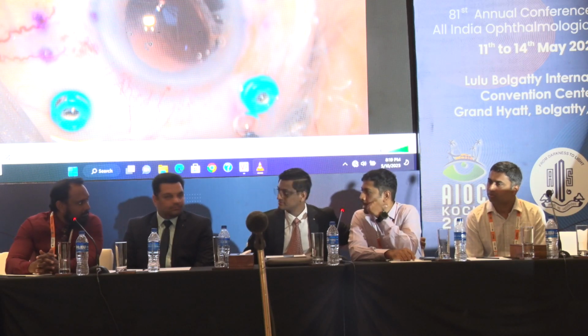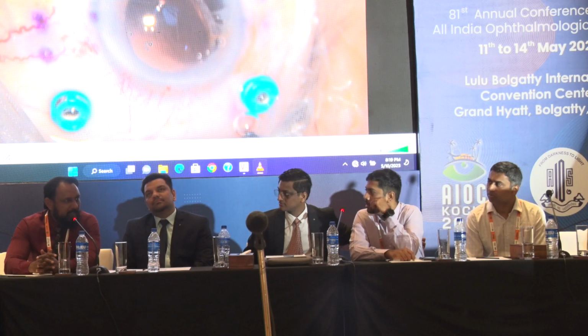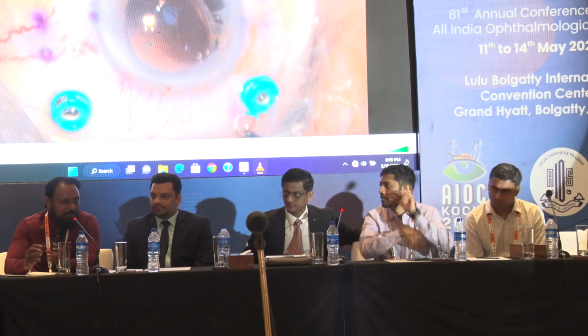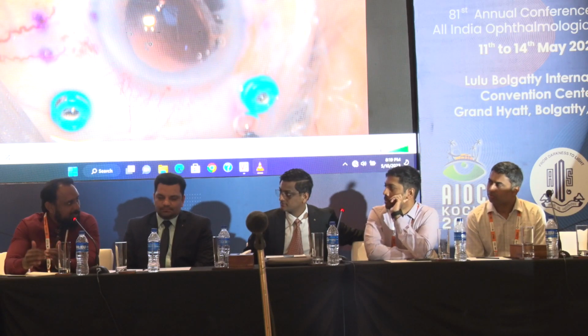How about the incidence of CME overall? I think it is slightly higher than the other SFIOL techniques, again because it is clipped on the iris, and sometimes you have these pigment dispersions and iritis coming recurrently. But that is one easy method out.